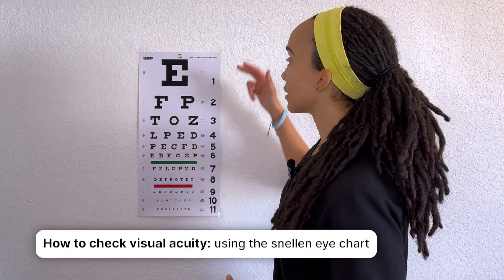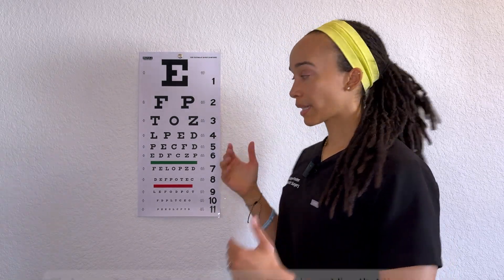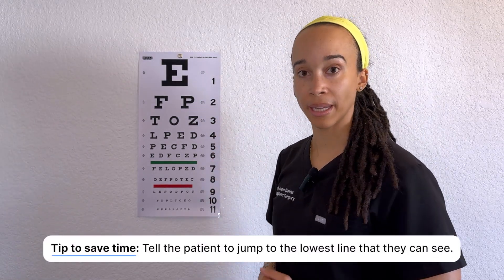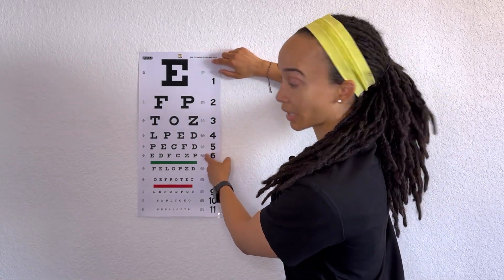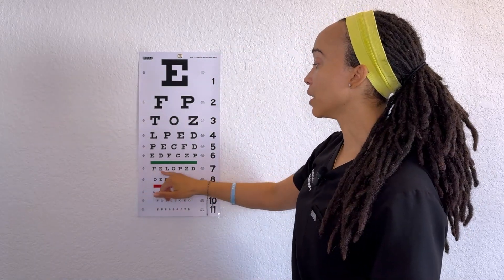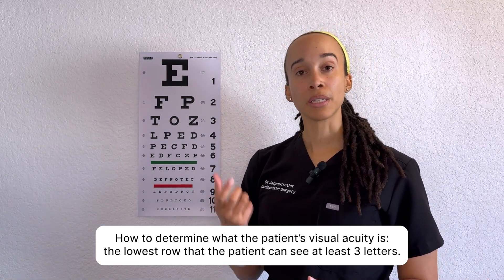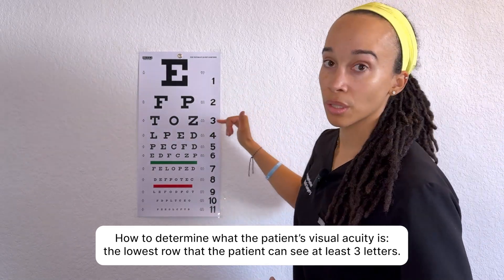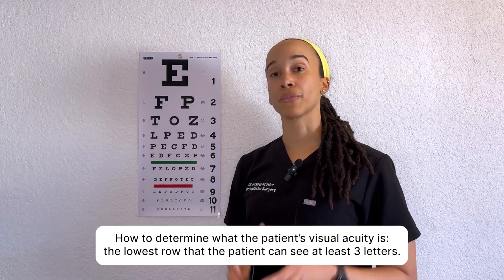For the eye chart, instead of having the patient start at the top big letter and work down — which takes time — have them jump to the lowest line they can see. If the patient can see the 20/25 line, you've skipped past everything above it. They need to see at least three letters in a row to qualify for that visual acuity. A helpful mnemonic: when they see three, they can see. So if a patient reads the full 20/50 line but only one letter on the 20/40 line, they're recorded as 20/50 plus one.